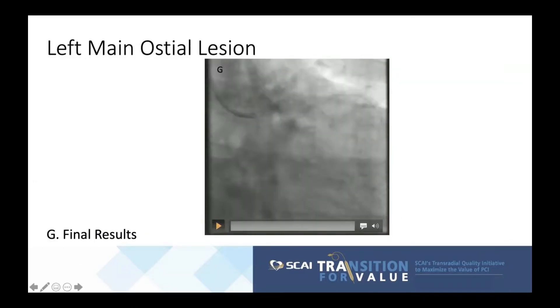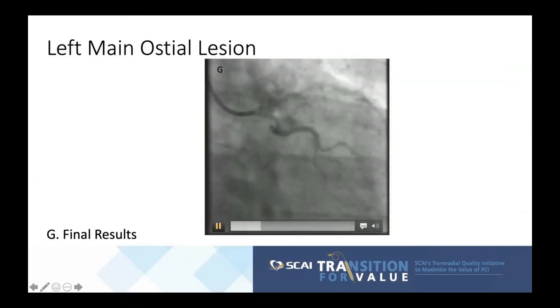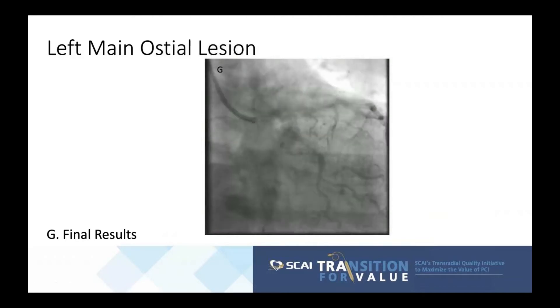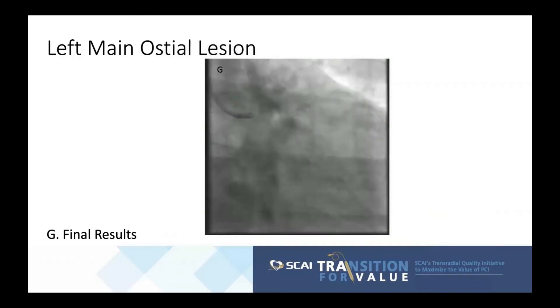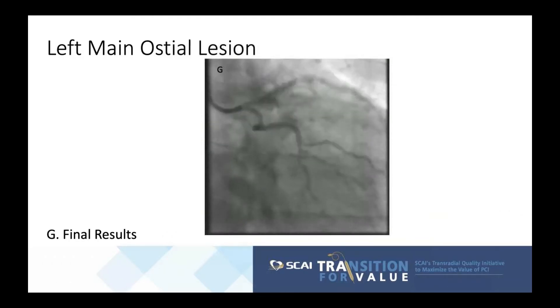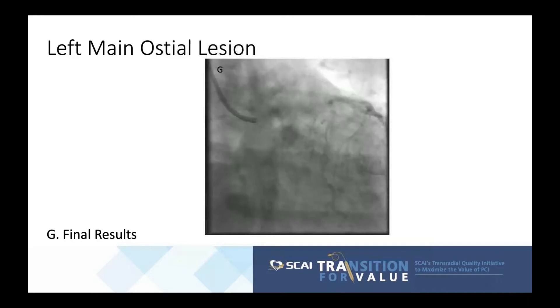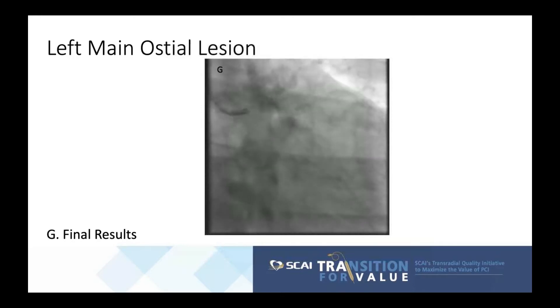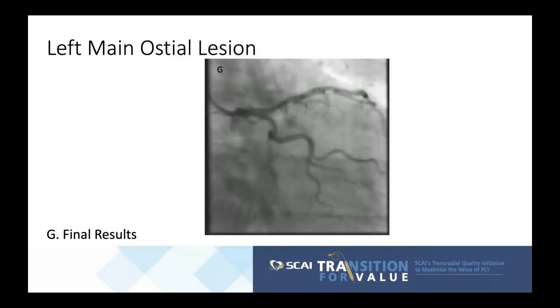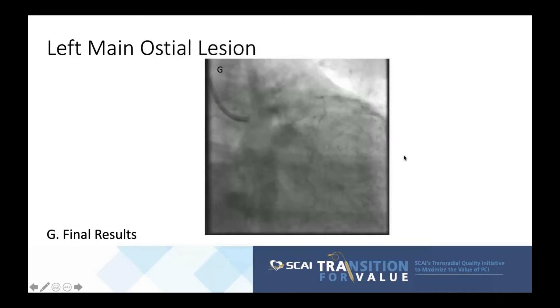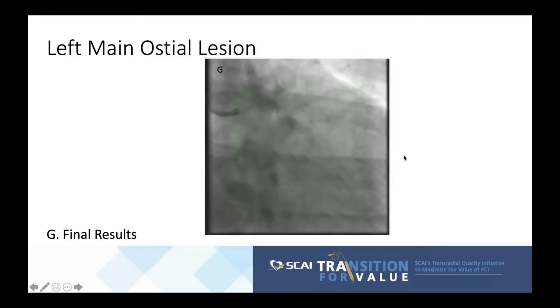The final angiogram shows excellent stent expansion. The procedure was uncomplicated — every step followed seamlessly — and the patient was discharged the same day.